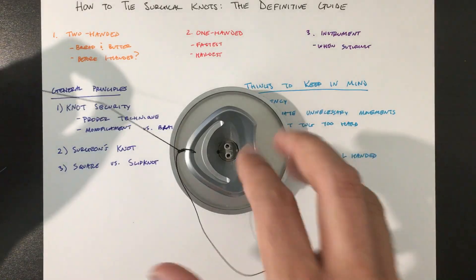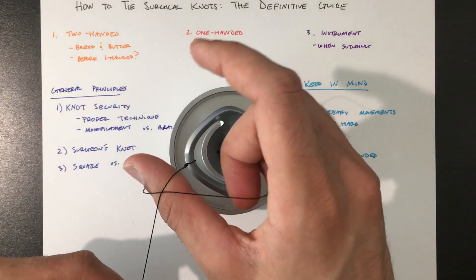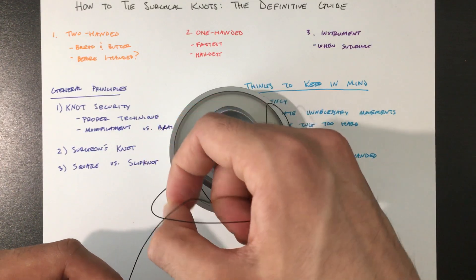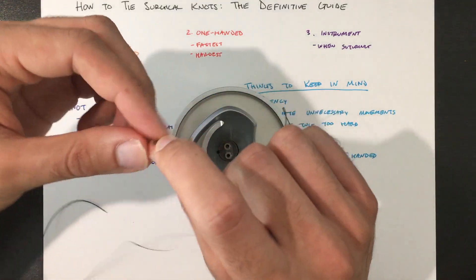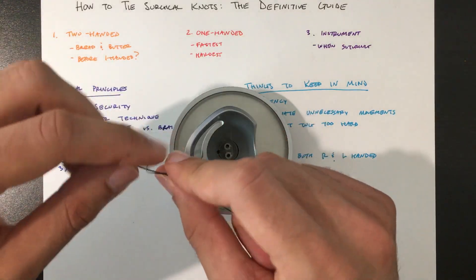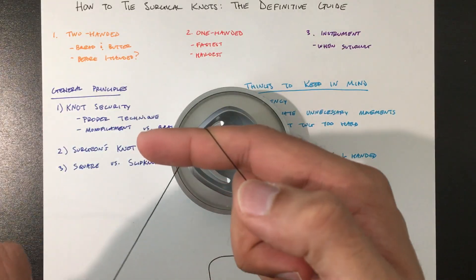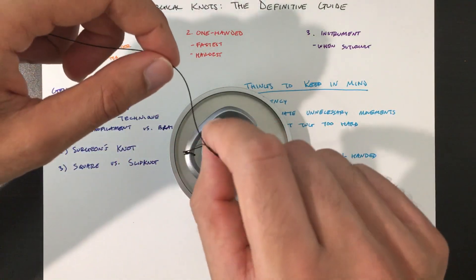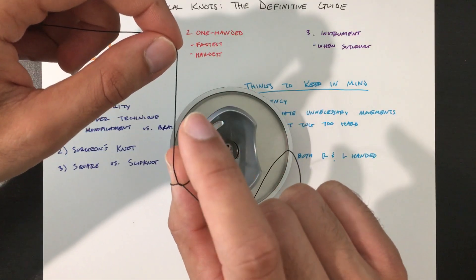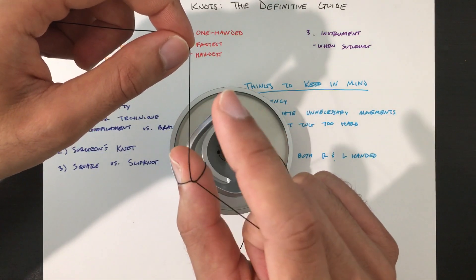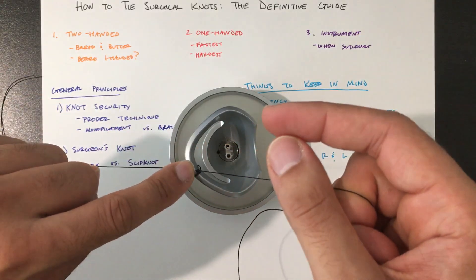Okay, now your thumb. So again, wrap it around your thumb, bring the other end in the opposite direction, make a ring, pass it through, pinch, bring it back. And one more time. Pinch, bring it back, pass it through, push down with your index.